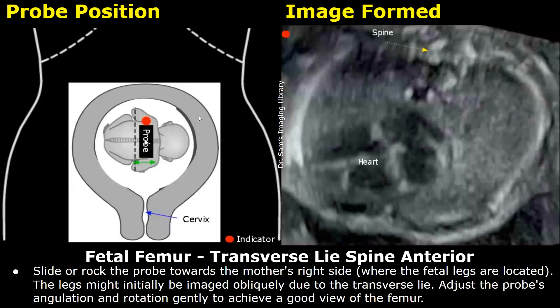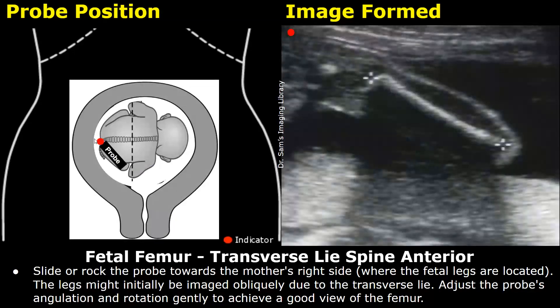This is a transverse lie where the fetal head is towards the mother's left side and the legs are towards the mother's right side. This image is formed at the level of the heart — the probe is in a sagittal orientation but gives a transverse view of the fetus. To find the fetal legs, move the probe towards the mother's right side. The fetal legs might be imaged obliquely due to the transverse lie; adjust the probe's angulation and rotation gently to achieve a good view of the femur.